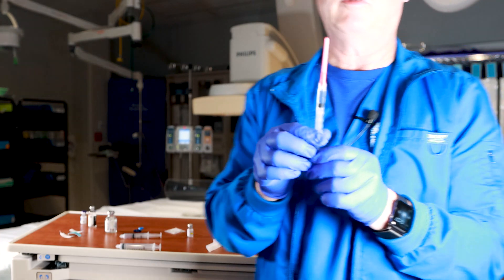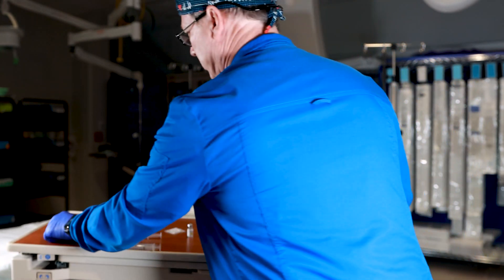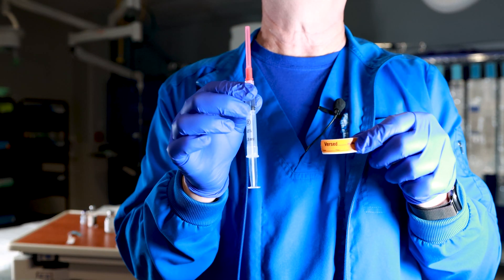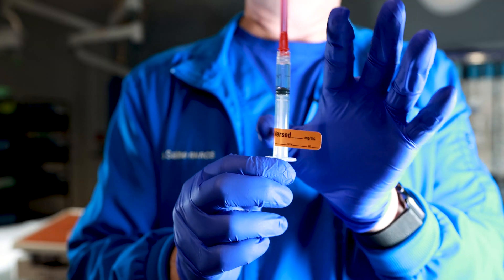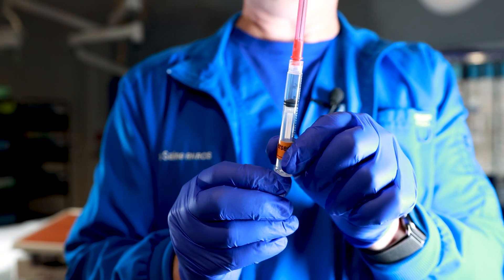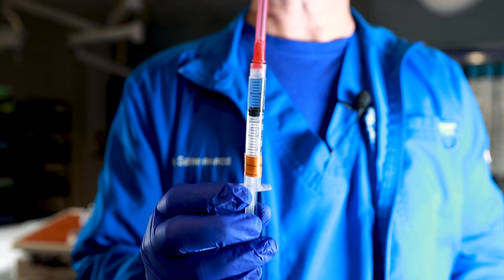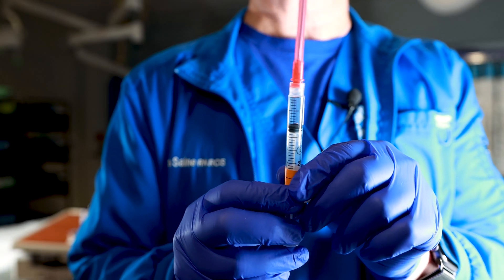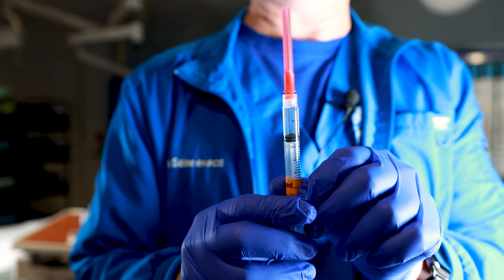We're pretending this is Versed. All medications should be labeled — the Versed has a label that comes off the vial and you date it and time it. Whether it's Versed, fentanyl, or a blank label, you label it yourself. So if this is Versed two milligrams in two cc's with one cc left, that's one milligram of Versed. If the doctor says give half a milligram, you push half a cc in.